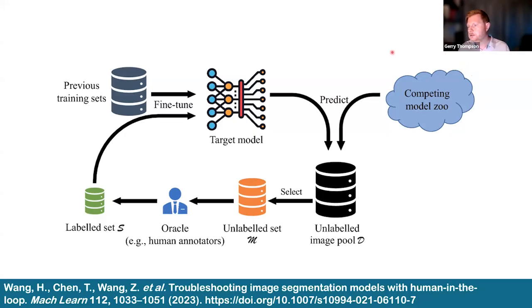But also importantly, the marketplace is essentially producer agnostic, the biomarker marketplace. You can come along, and as long as you can containerize your model or your preferred approach, there is this competing model zoo, and you can even set up internal competition for these to try and work out which is the best. But having that human in the loop instead of excluding the radiologists, but having it done in a very efficient way is really helpful to try and make the most of your data.